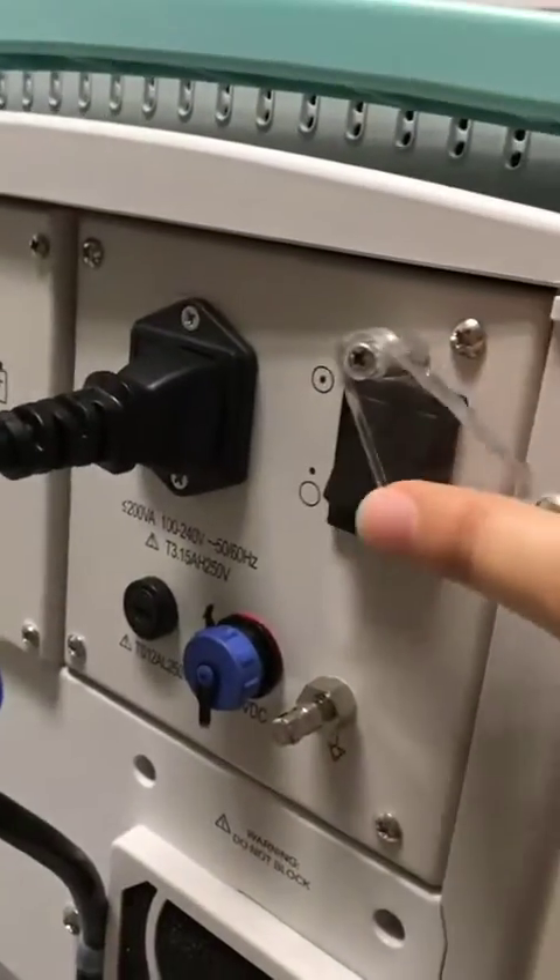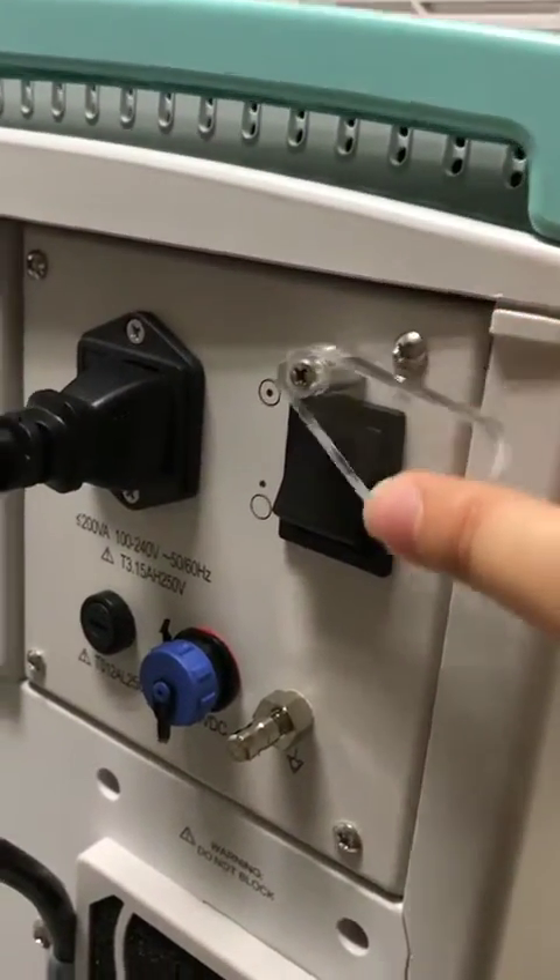To turn it on, there's a button around the back. You've just got to flick the Perspex cover and switch it on.